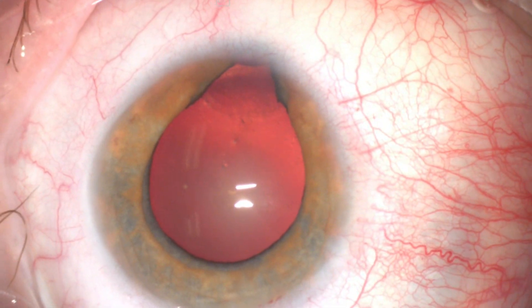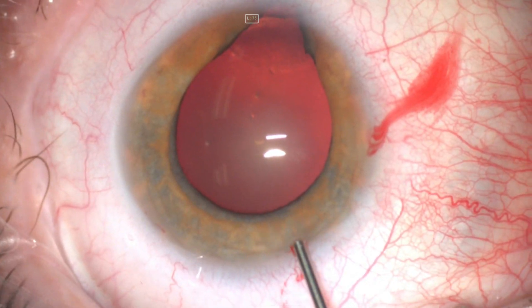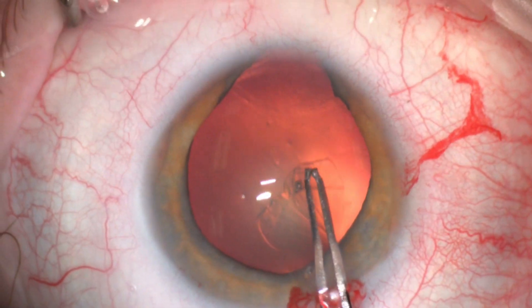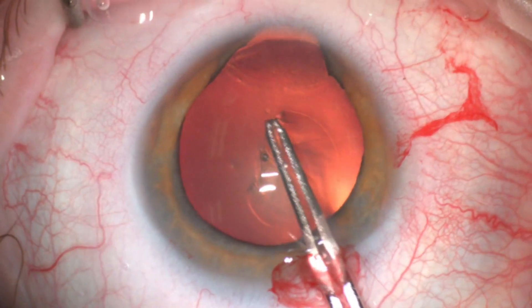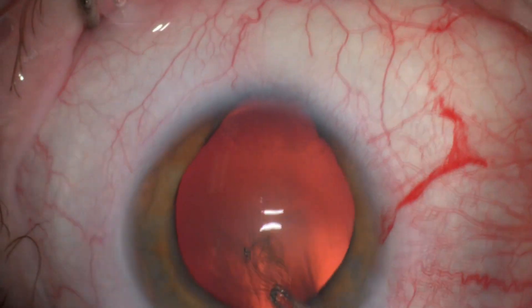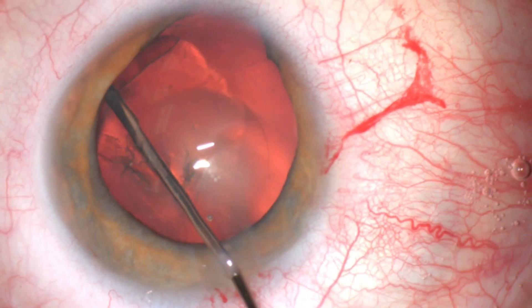Cataract surgery started in the standard fashion making the main incision and two paracenteses. Centering the capsulorhexis is really essential in this case, also to avoid the area of the lens dehiscence inferiorly.